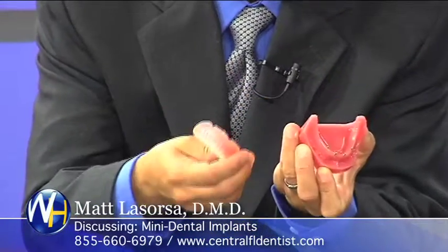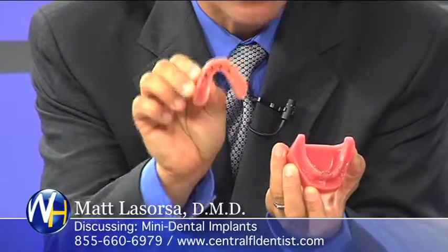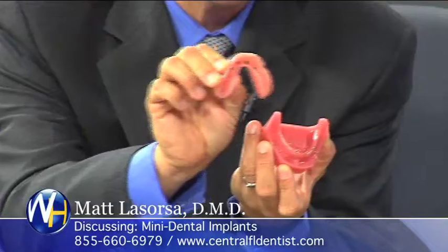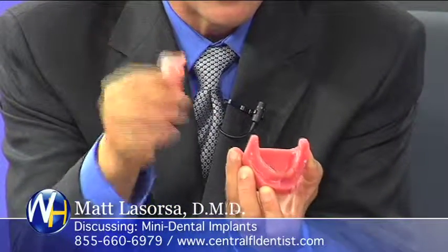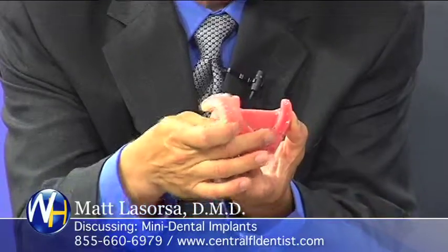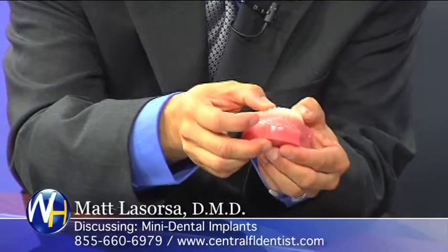Okay. And then what we do is we put these housings inside the denture. Can you see that? These housings are inside the denture, and this is what snaps onto the ball of the implant. Let's take a look. Is this how snug it'll be? This is absolutely how it'll be. You can try this on. Very nice.